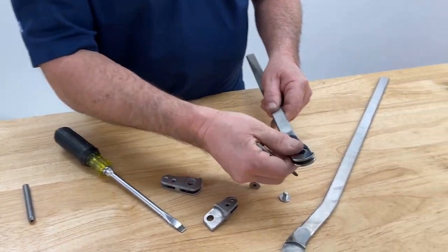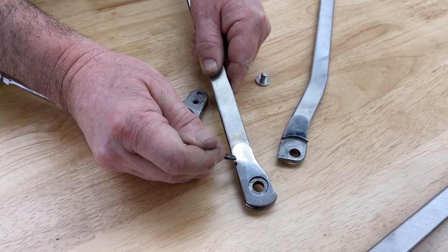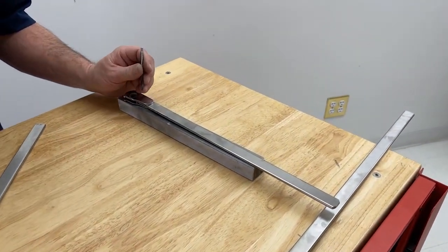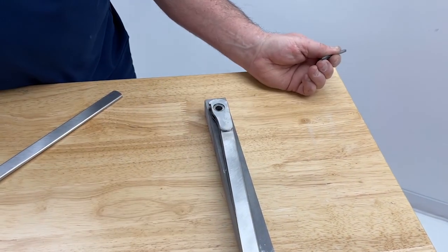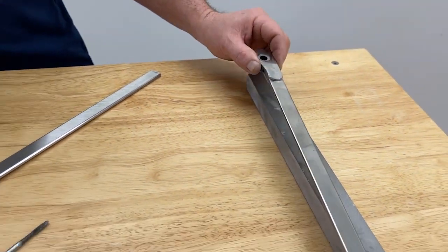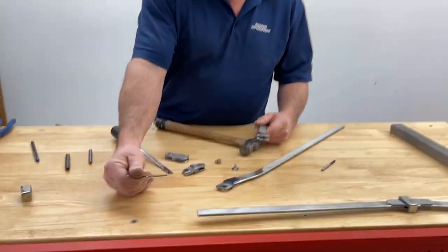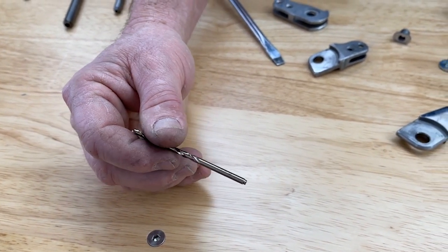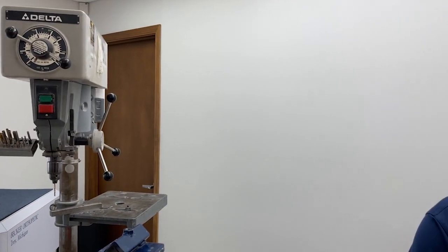First, start by marking the area. We identify where the rivets are and identify the area where we want to put our ball, and I'll center punch it. We use cobalt drill bits here, not high-speed steel drill bits. Cobalt drill bits are best for the hardened stainless steel. I've already set the stop on the drill at 3/16ths.